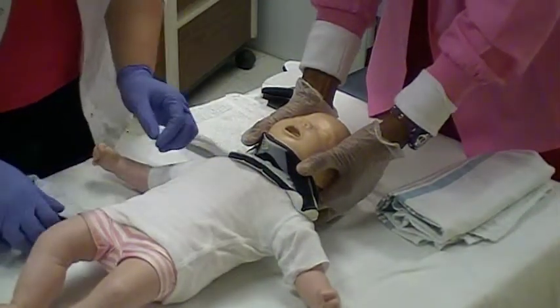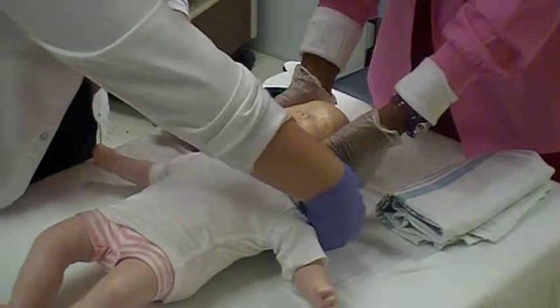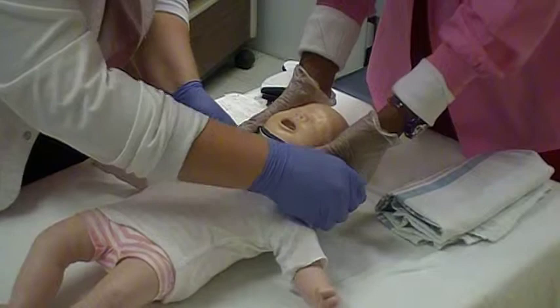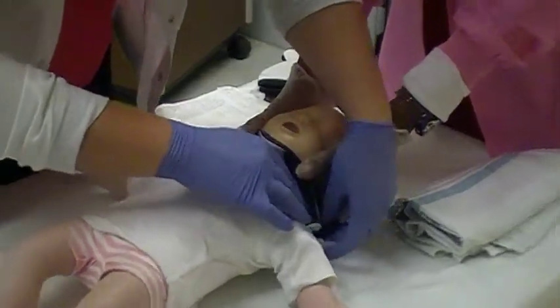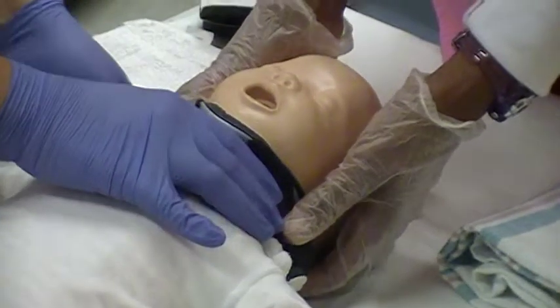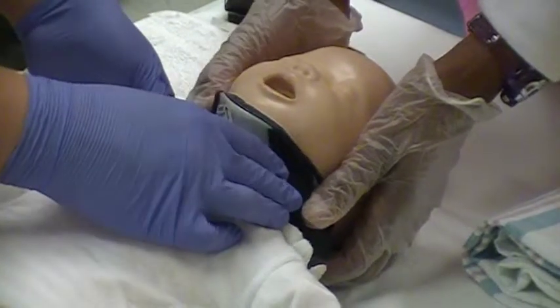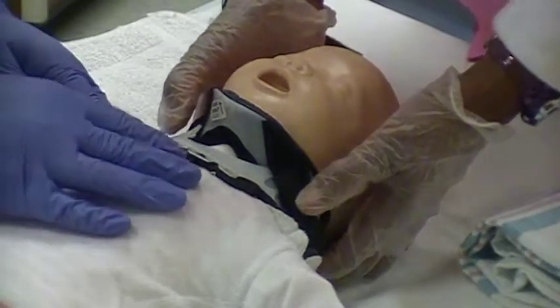Center the back portion of the collar behind the child's neck. With the front portion properly positioned, use the bilateral hook straps and fasten the portions together. Remove slack from the collar to prevent movement and migration. Fasten the straps one side at a time to equal lengths. Ensure that no gaps are present.